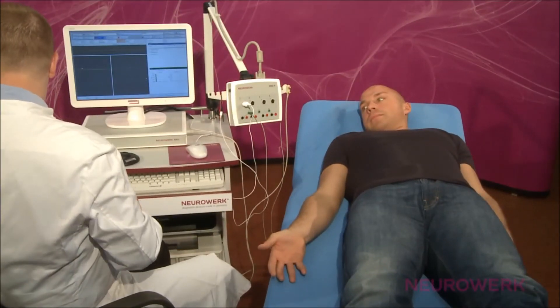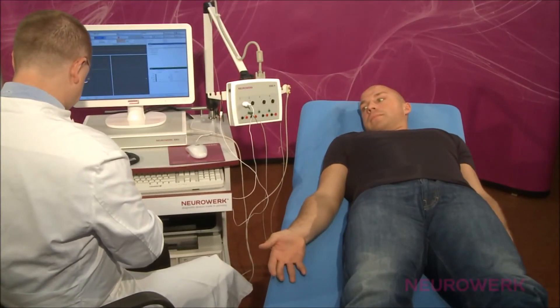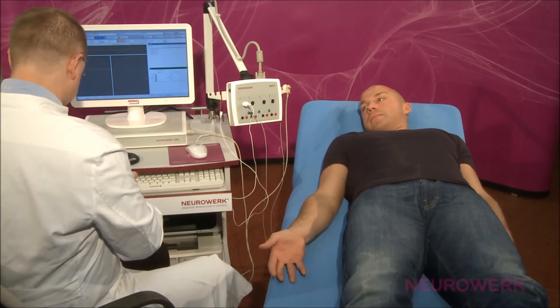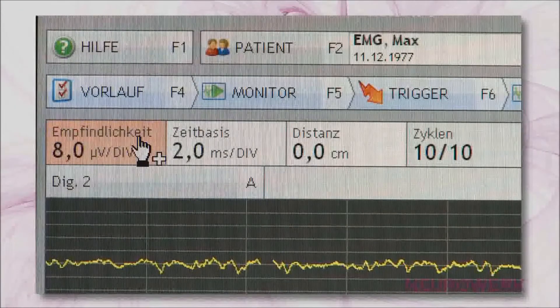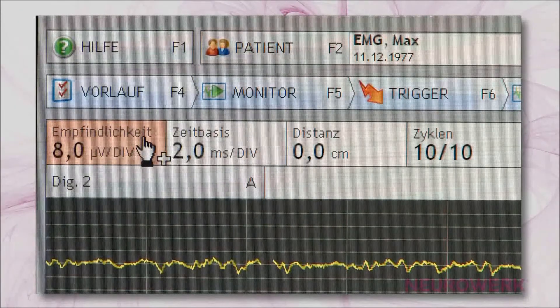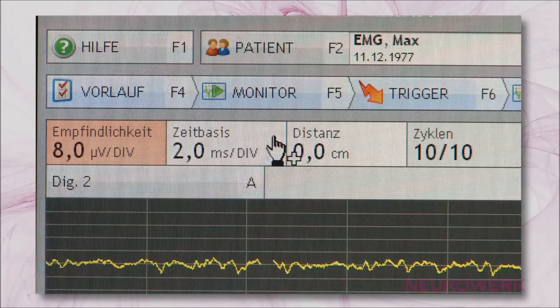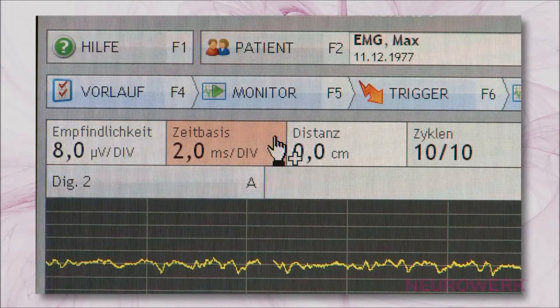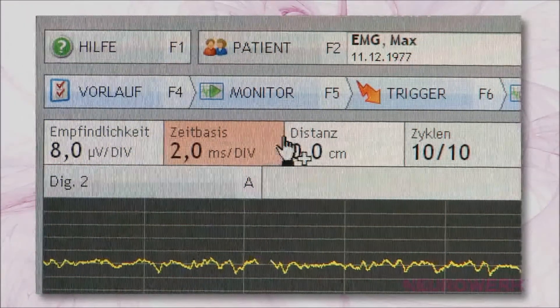The instrument settings for sensory neurography should be selected as follows: Amplification 8 µV per division, Time base 2 ms per division.